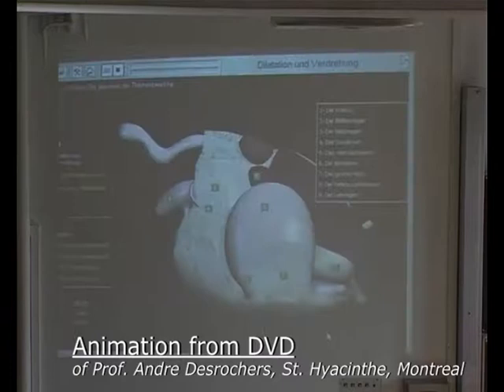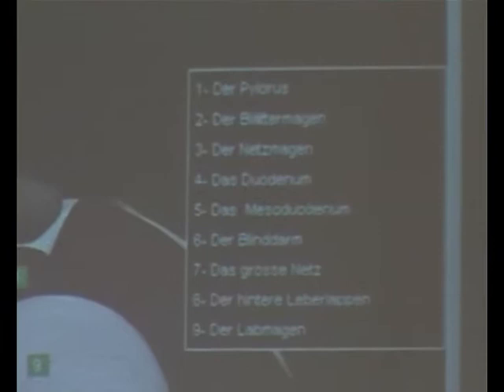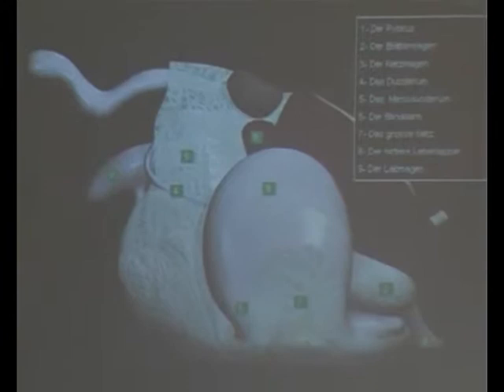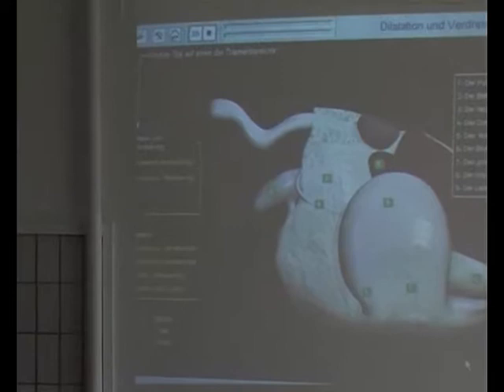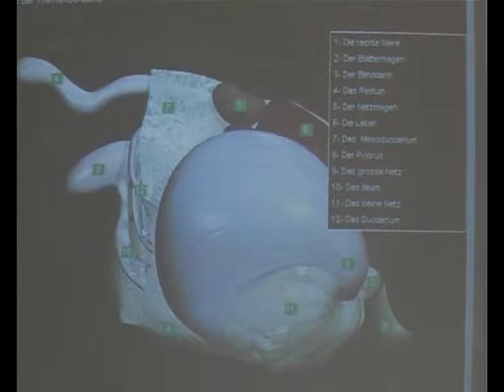If we have only a dilatation and dislocation on the right side, we see the pylorus back in this position. This is a sign that we have no torsion or volvulus of the abomasum, but it's difficult to decide this only with our endoscope. And if we get the torsion, then you will see that we have torsion and volvulus, and the pylorus is now in this situation cranial. And that's the problem. If we fix this abomasum blind with roll and tack, we will fix the abomasum twisted. So it's not useful to fix the right displaced abomasum with roll and tack.